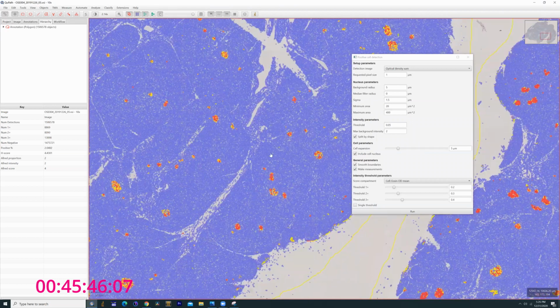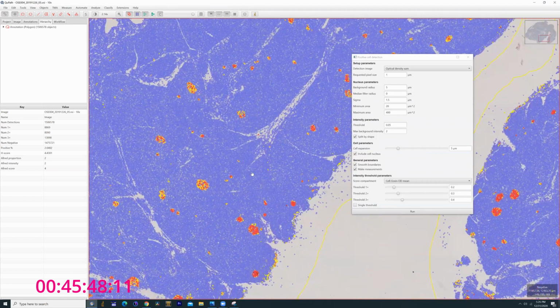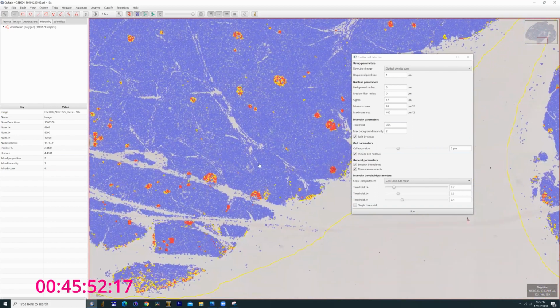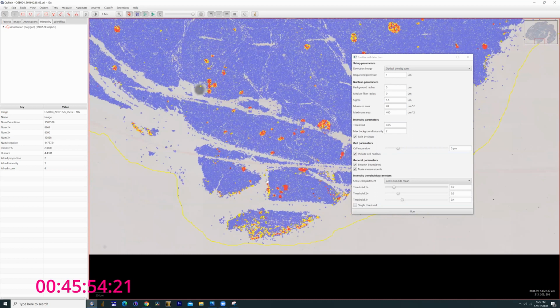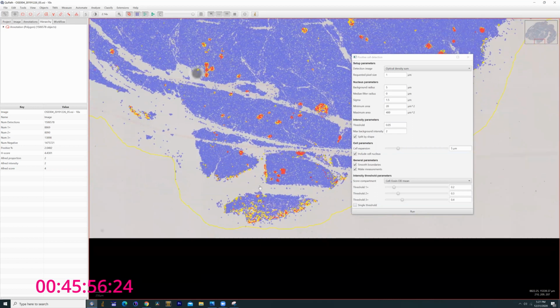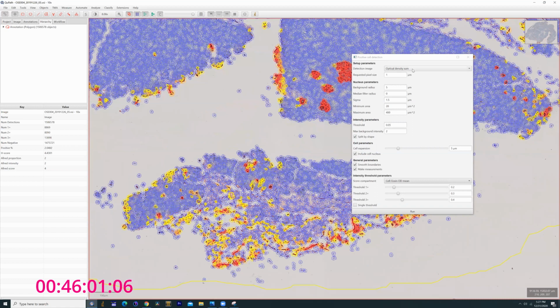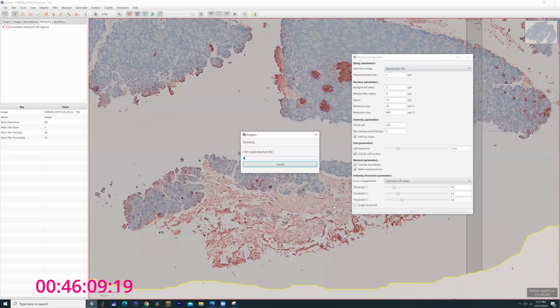So with that being said, I think I'm going to stop for dinner, and just before we go, let me try one more option here. We will try the hematoxylin stain as a counter, because one of the things I did notice, the hematoxylin does not stain this connective tissue as well.